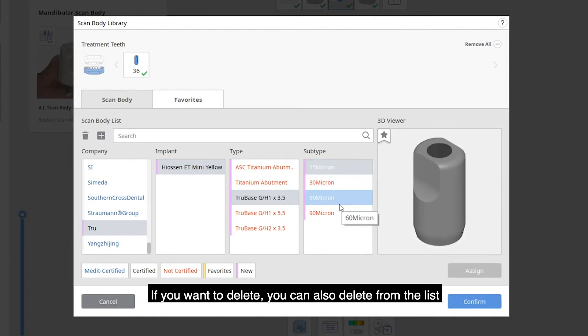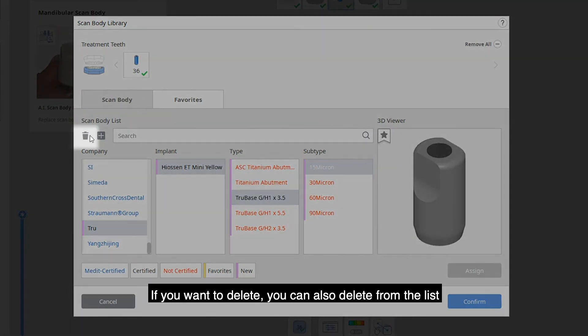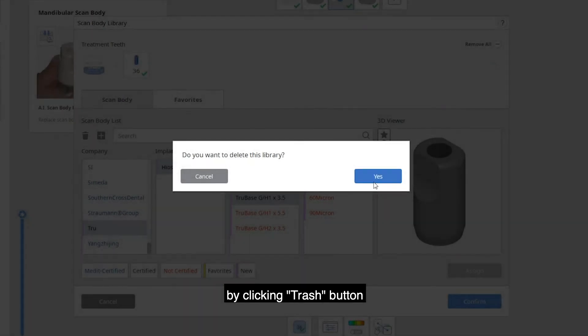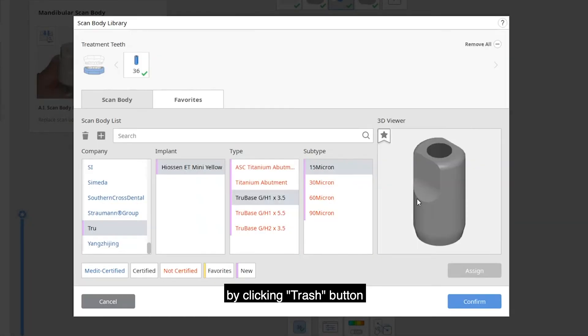If you want to delete, you can also delete from the list by clicking the trash button.